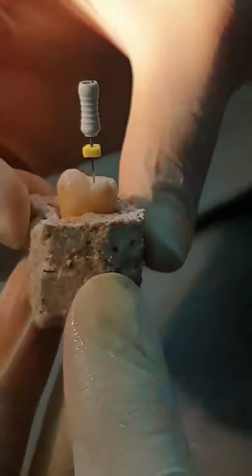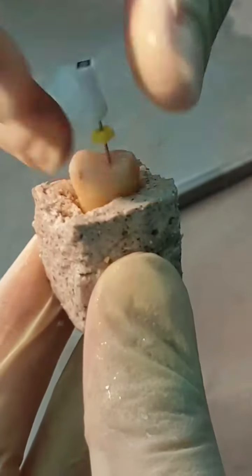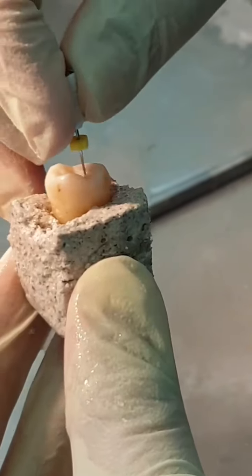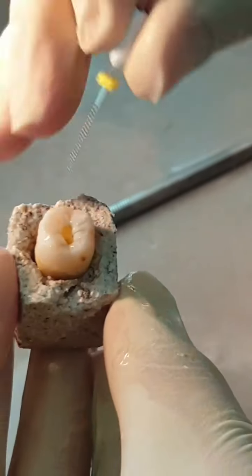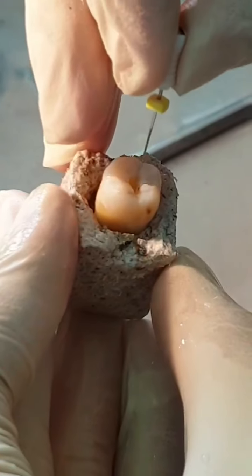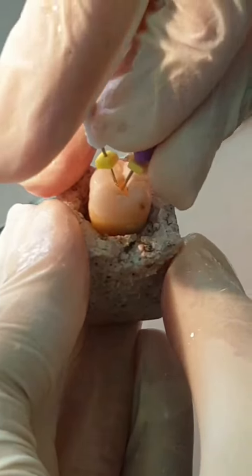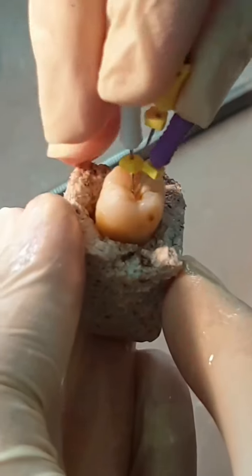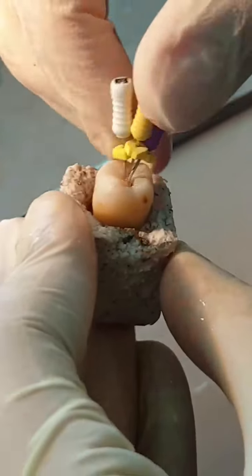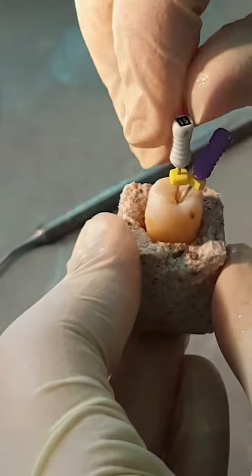Now we are going to check straight line access in the canals. In distal canal we have enough straight line access. Also in mesiobuccal canal. And also in mesiolingual canal we have a straight line access. As you see, we found 3 canals in this case.